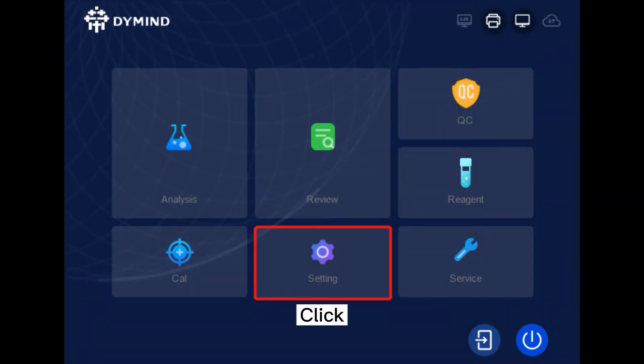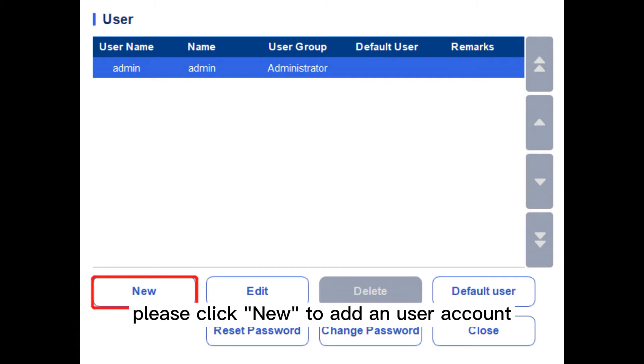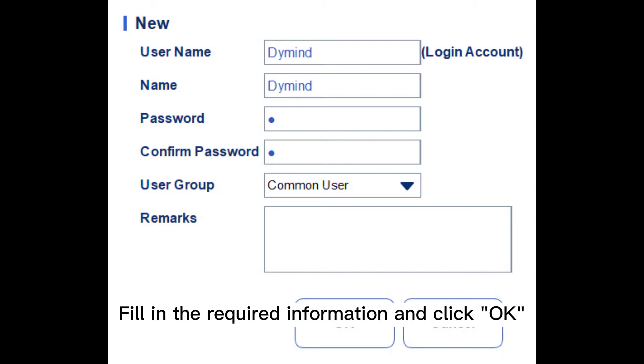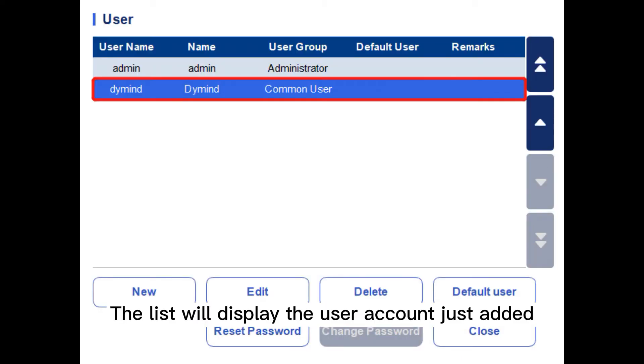Click Setting, then User, to enter the user management interface. Please click New to add a user account. Fill in the required information and click OK to save it. The list will display the user account just added.